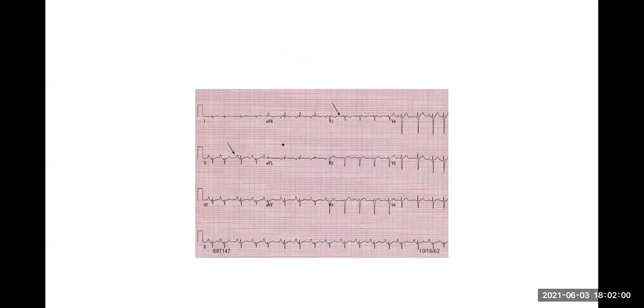Now, this is another abnormal type of P wave. As you can see, it is very tall. A very large looking P wave, and that occurs when there is right atrial hypertrophy, hypertrophy of the right atrium. And this is called P pulmonale. You get a very tall P wave, a peaked P wave, and that is called P pulmonale. Right, so that is about the P wave.